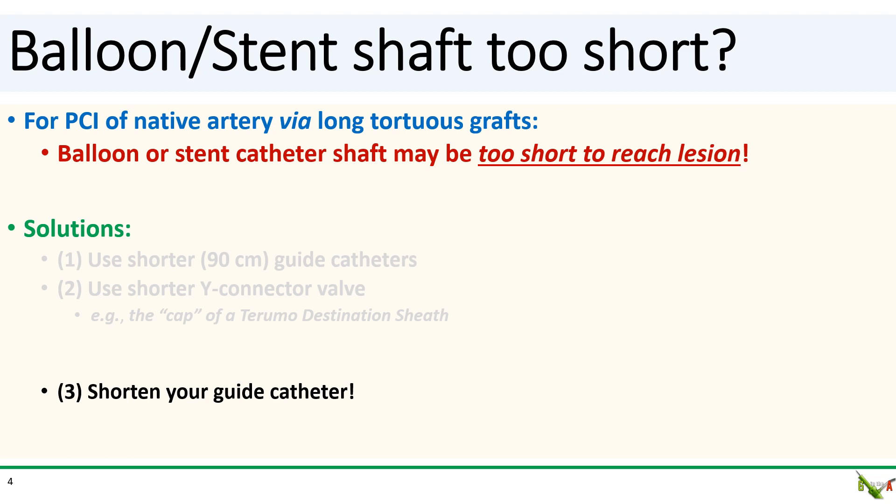You'll have to bleed back via the side port. If you need more than just a couple of centimeters, the other option is to shorten your guide catheter.